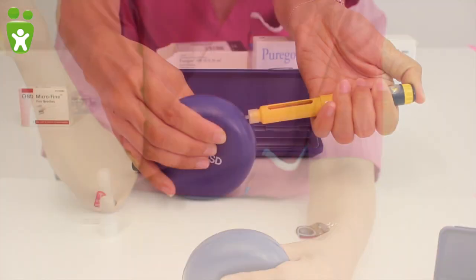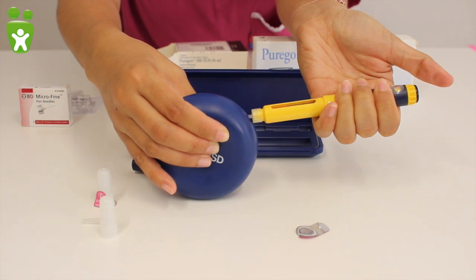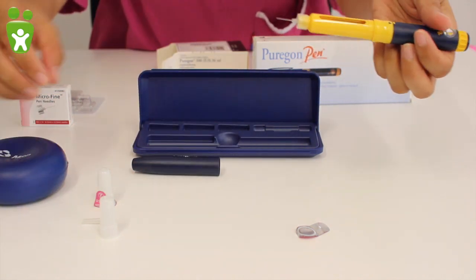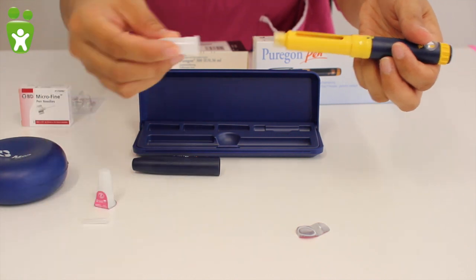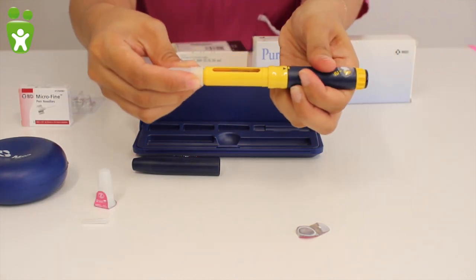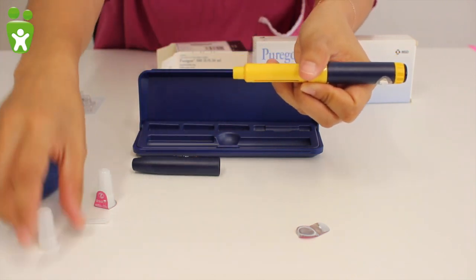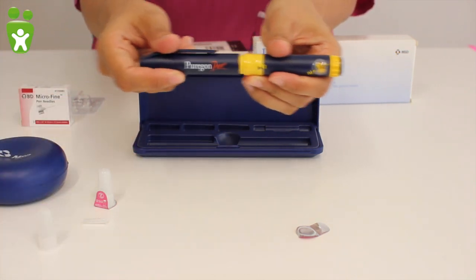Once the injection is finished, the skin fold can be released and the pen removed. Afterwards, place the cap on the needle and with its help, unscrew the pen. The pen should then be placed in its box and returned to the refrigerator.